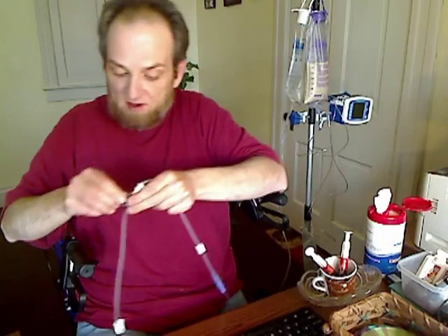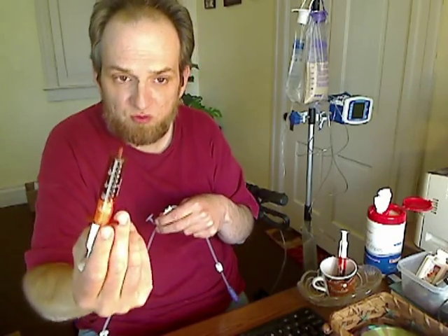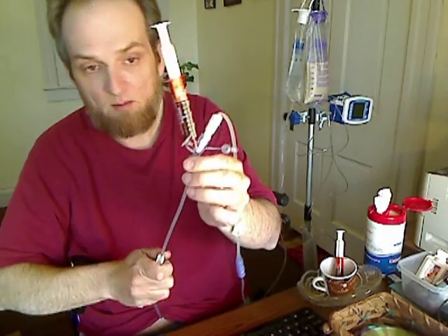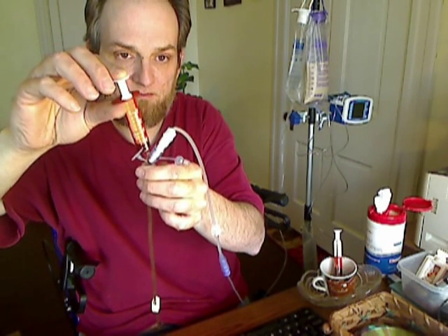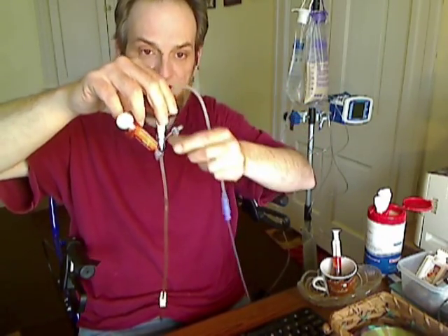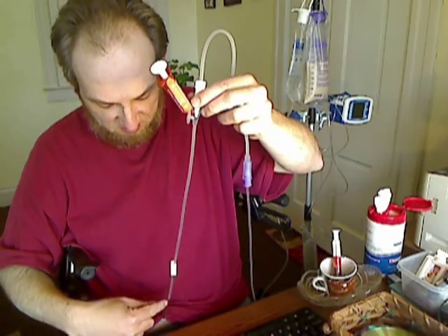And I'm going to go ahead and open up the medicine port. Take one of my syringes that has medicine in it. I'm going to go ahead and put it in there, in the medicine port. We'll go ahead and open up the stomach to the feeding tube, and I'm going to slowly push in my medicine. As you can see, the medicine is in there. Now with the syringe still in, I'm going to open my water, and as you see, hopefully you can see, the water is pushing in the medicine.